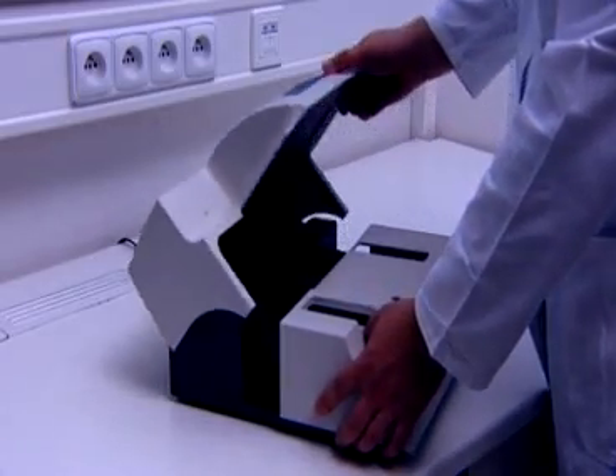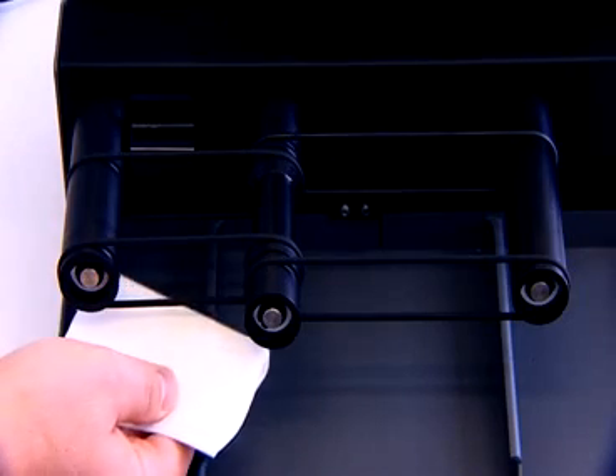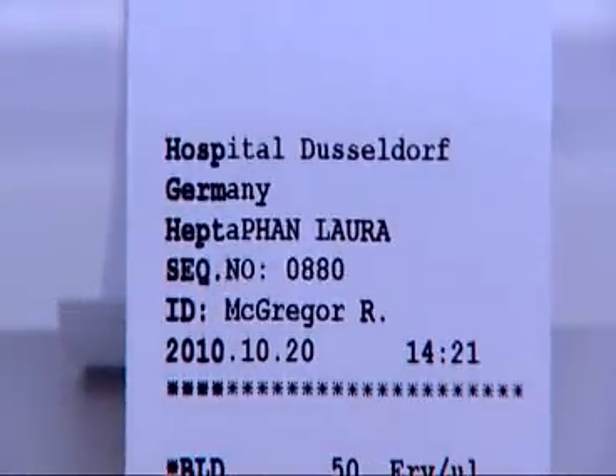The machine is adjusted to the highest hygienic requirements of clean work, and its cleaning and disinfecting are easy to accomplish. The LAURA reader is the standard for quality analysis, reliable results, and satisfied users.